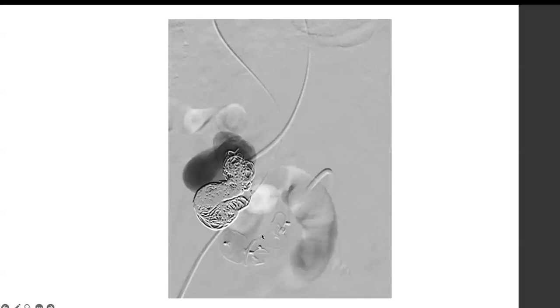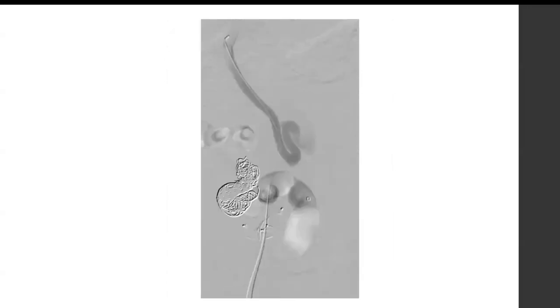These can be very difficult to close. They have a lot of flow through them. So we've shut that one down, and then retract everything. So this is the shunt that we closed, that retroperitoneal kind of shunt thing. And then now we're back in the recanalized umbilical vein.